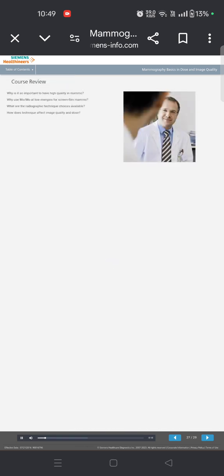So let's revisit our learning points that we showed at the beginning of this module, where we asked, why is it so important to have high quality mammo? Why use moly at low energies for screen film mammo? What are the radiographic technique choices available? And how does technique affect image quality and dose?